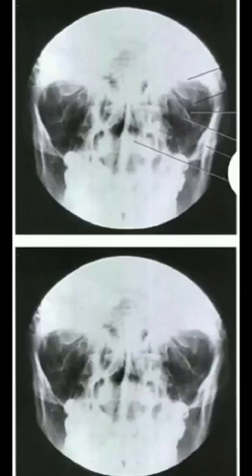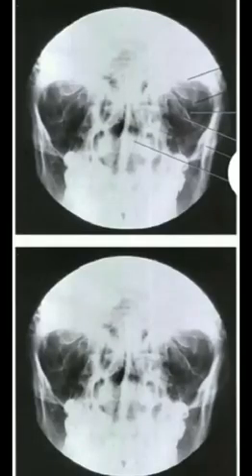Central ray directed at an angle of 20 to 25 degrees cephalad and exiting the nasion. The central ray enters the midline approximately 3 inches, 7.6 cm, below the external occipital protuberance. Center the IR to the central ray. Note: decreased exposure factors are typically used because the central ray enters below the cranium. Therefore, less penetration is required.